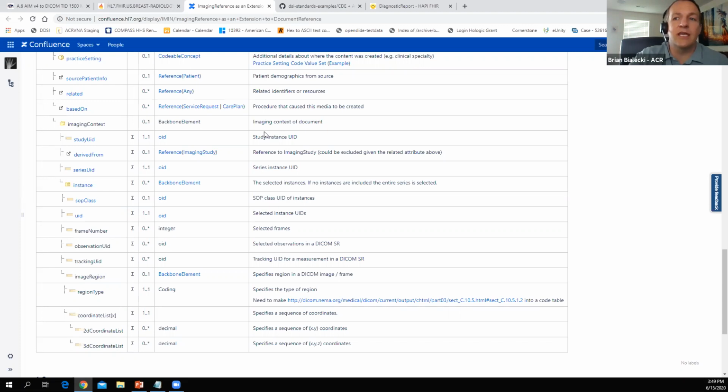This would work the same if I used a CAD SR. This extension is only for when I want to specifically call out a particular markup. Those use cases already worked. So if I wanted to build a DICOM SR and bring that up, that was available. Or if I created a GSPS, I could point to those directly without specifying the coordinates inside of them.